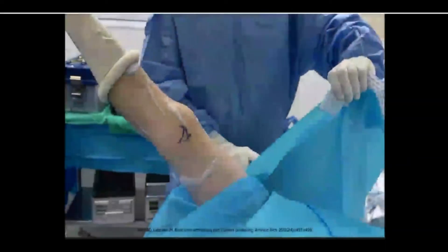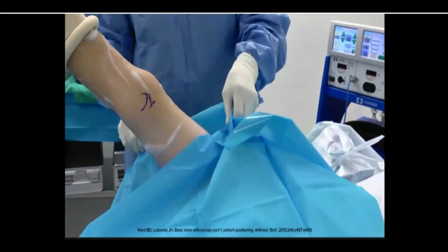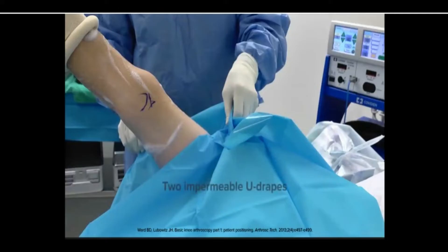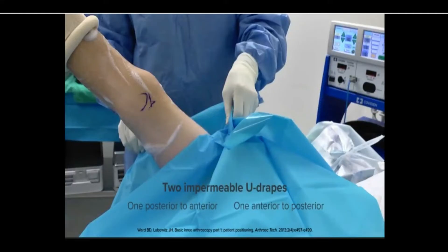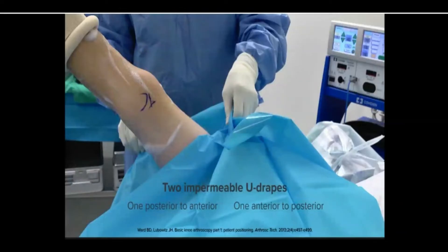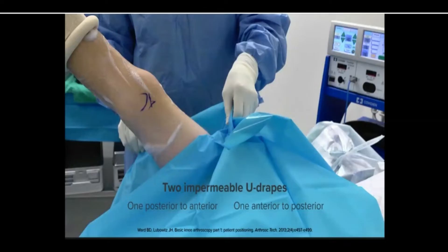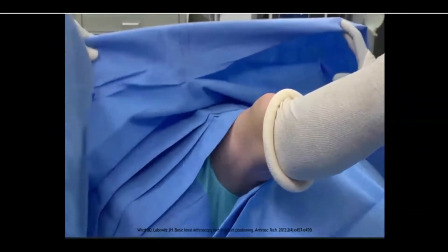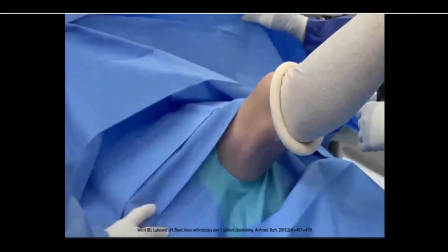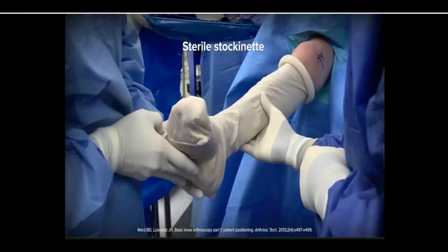The operative extremity is draped out in accordance with the planned procedure and the surgeon's preferences. The drapes usually consist of two impermeable U-drapes — one attached from posterior to anterior and the other in the opposite direction — just distal enough down the thigh to cover the tourniquet. Next, a large extremity drape providing a large sterile field is placed around the leg. The foot and lower leg is often covered in sterile stockinette as well.